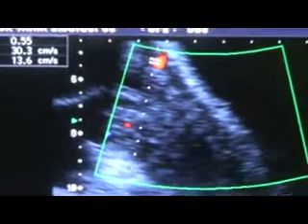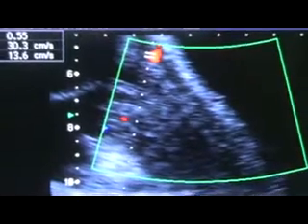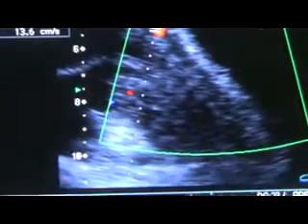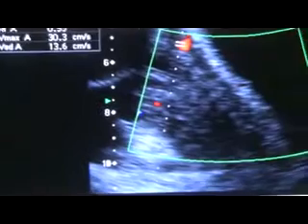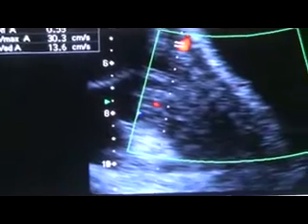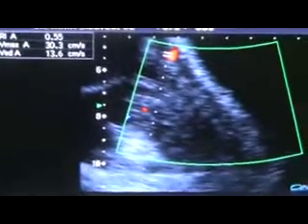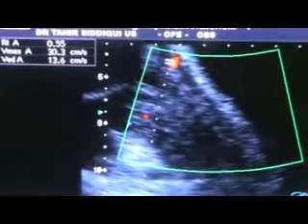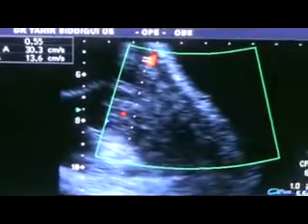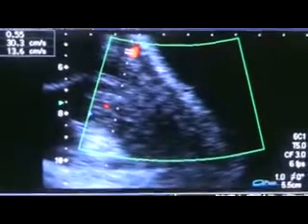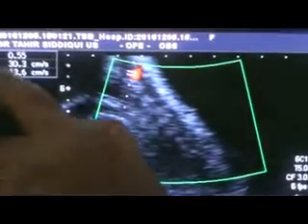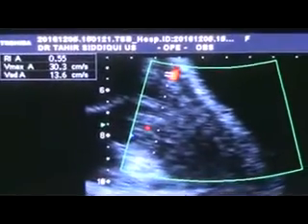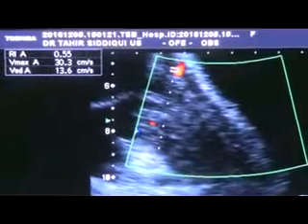This is an obstetric ultrasound of a primigravida at 25 weeks gestational age. You are seeing the uterine artery, which gives a resistive index of 0.55.